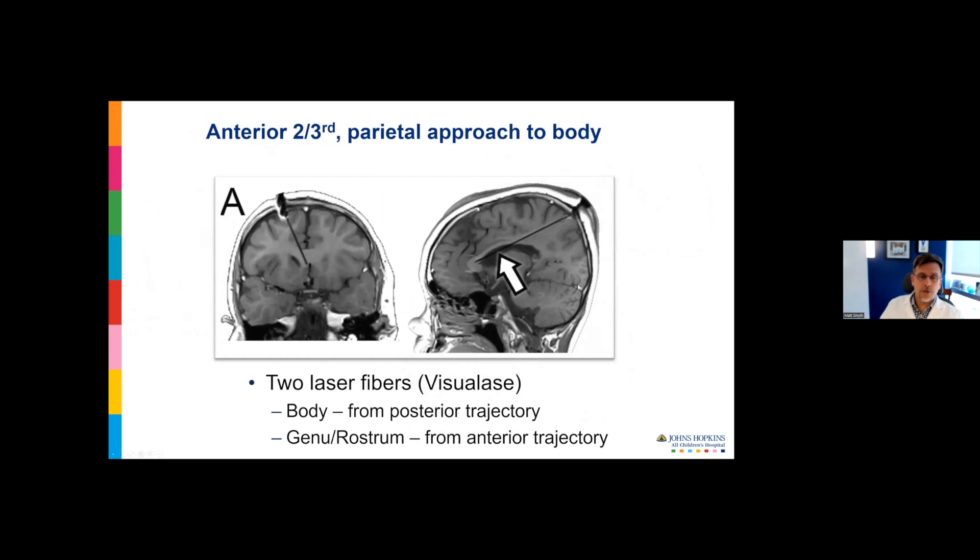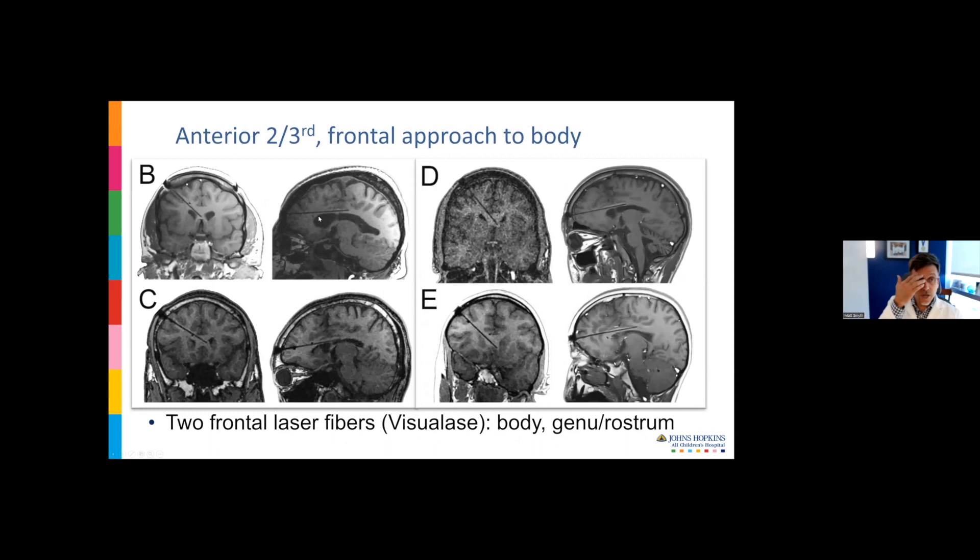Once I'd gained confidence with single fiber ablations, we started doing anterior two-thirds ablations with a catheter coming obliquely in the frontal area near the hairline, down to get the genu and the rostrum. I was trying to avoid putting catheters near the forehead. You can see the problem with this suboptimal position of the laser catheter. Despite excellent registration, some deflection occurred, perhaps with drilling or when the fiber hit the dura, and the catheter went too low and missed most of the callosum. We had to reposition the catheter.